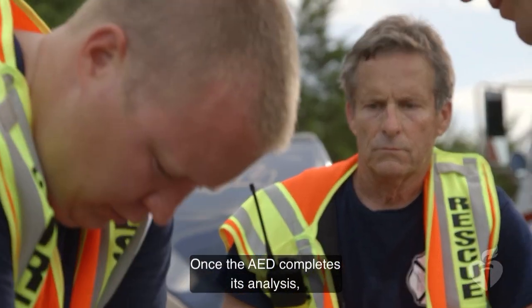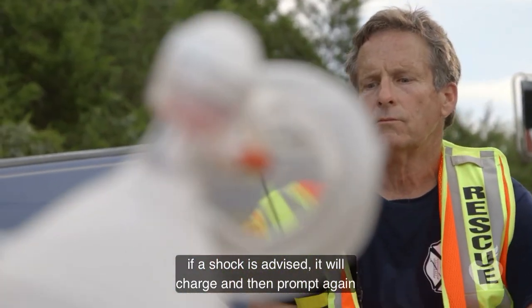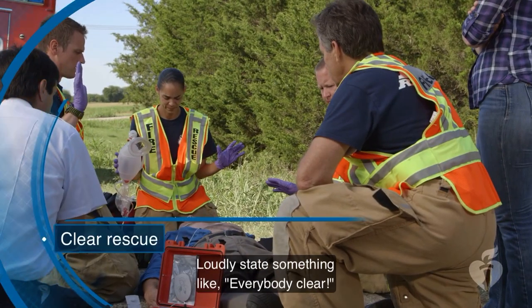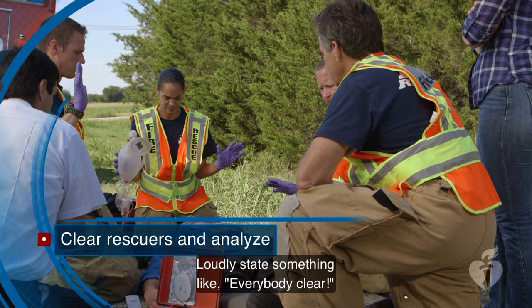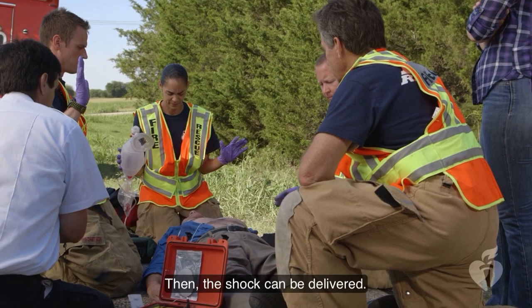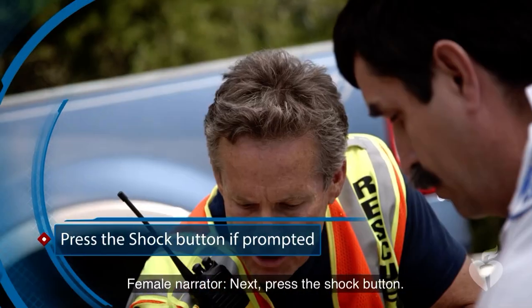Once the AED completes its analysis, if a shock is advised, it will charge and then prompt again to clear the victim. You'll repeat the command to those nearby. Loudly state something like, "Everybody clear," and visually check to make sure that nobody is touching the victim, not even the person in charge of giving breaths. Then, the shock can be delivered. Next, press the shock button.